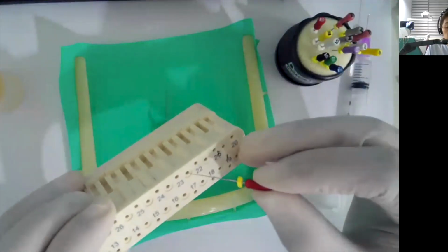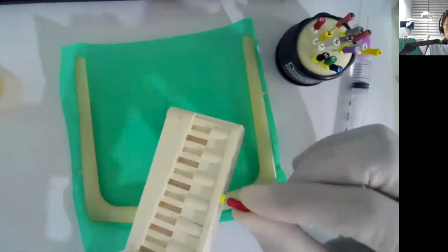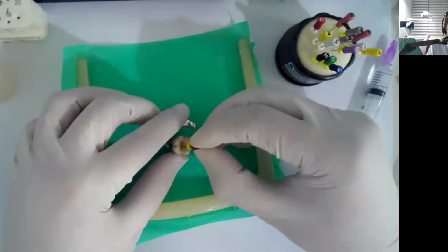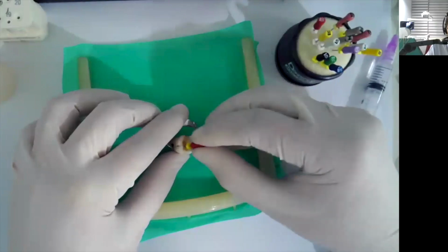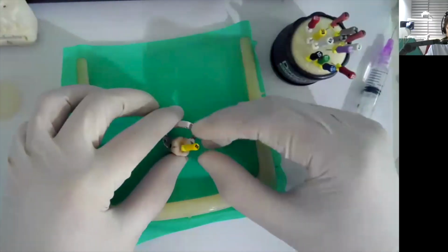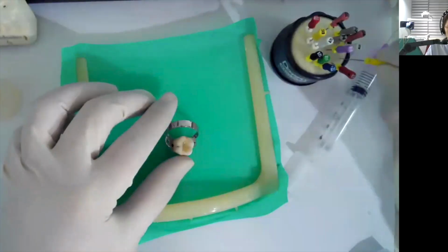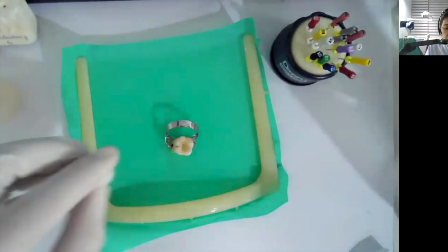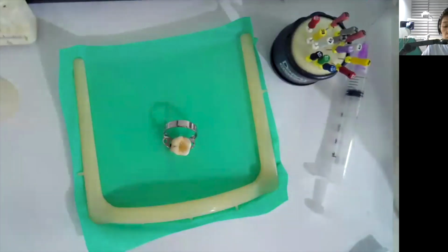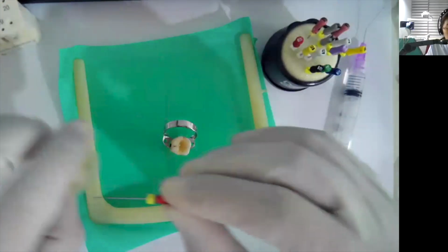This now be my MAF, measured at 22.5. Put some EDTA on it, do some watch winding technique. So if it can't reach the working length, what are you supposed to do? I'm just recapitulating. Let's irrigate again until it's clear. I'll go back to 25, put some EDTA.